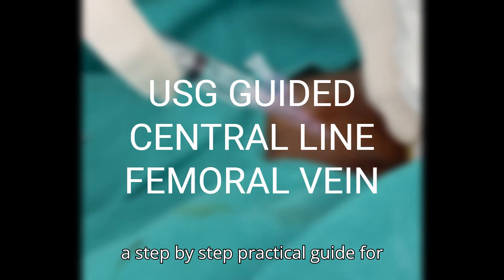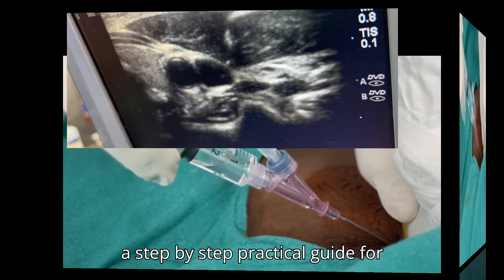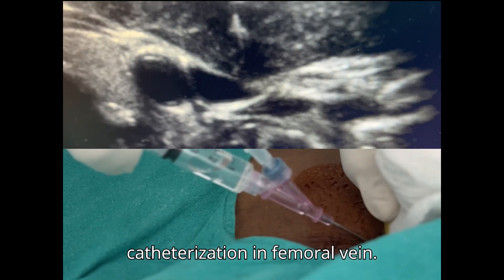Hi everyone, this is a step-by-step practical guide for ultrasound guided central venous catheterization in femoral vein.